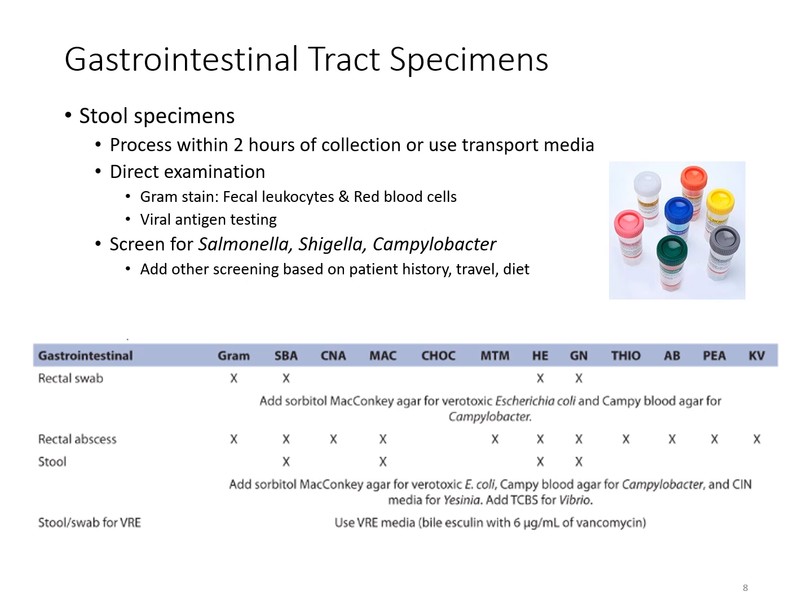Depending on if they want to look for parasites or just bacteria, what they're looking for will determine which collection container is used.